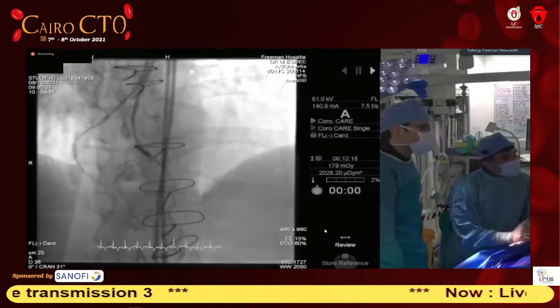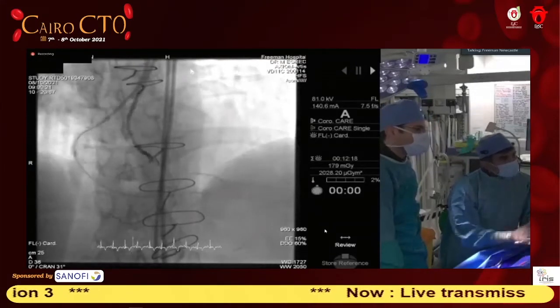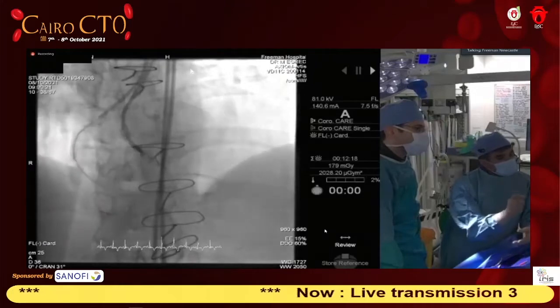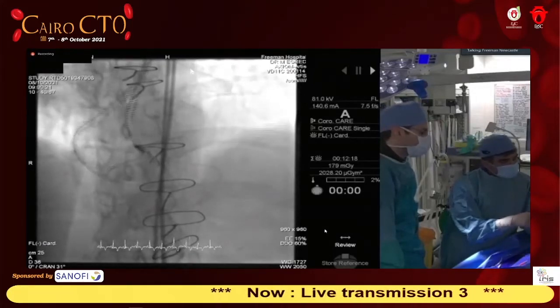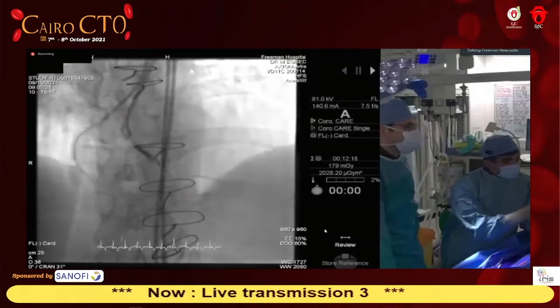It's got the rod at the tip. It's a very, very nice wire to handle through any CTO, to be honest. And with the MG, called micro gap, when you're trying to knuckle, you have no control where the knuckle will form, particularly with the Pilot 200. So the knuckle could be quite big.